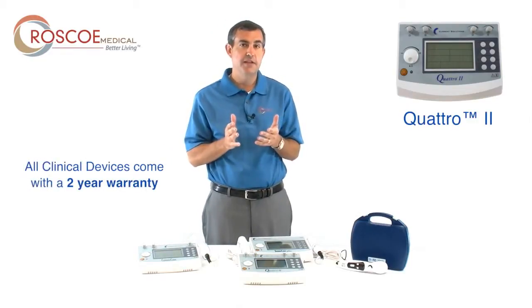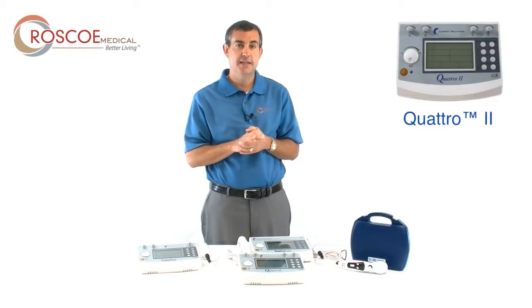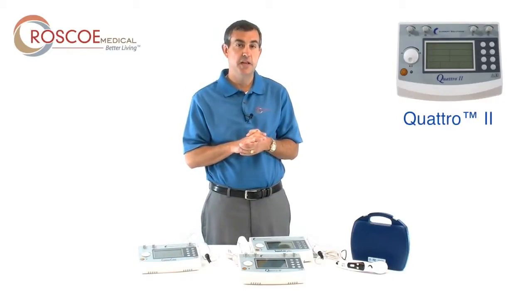All of our clinical devices come with a two-year warranty. We also support you after the sale with a tech desk that is staffed Monday through Friday, 8 to 5. We respond quickly — just let us prove it to you. That's the Quattro 2, a four-channel fully functional electrotherapy device.